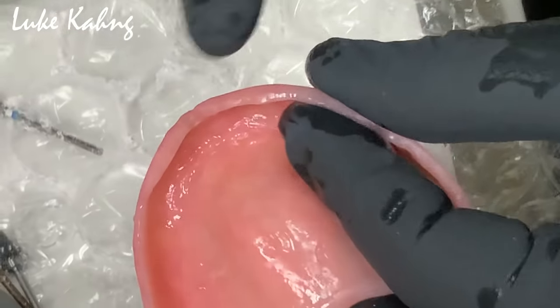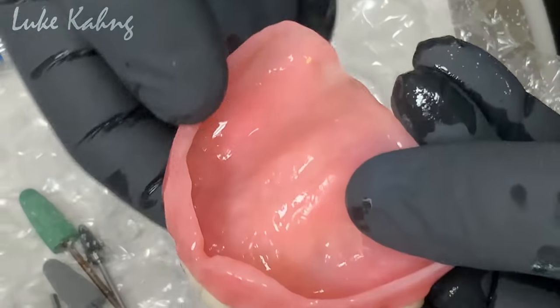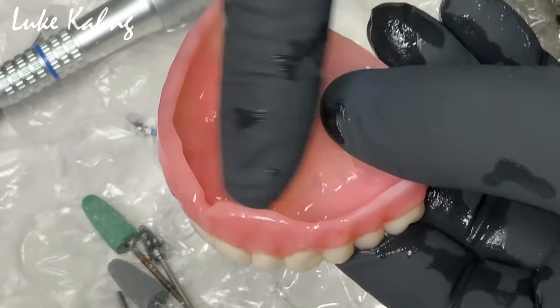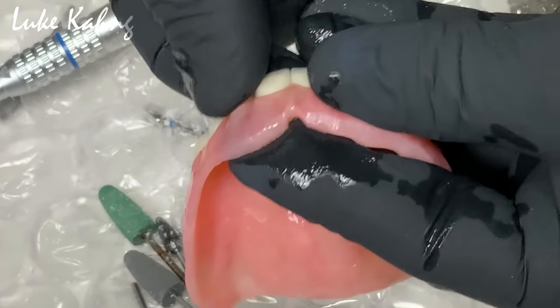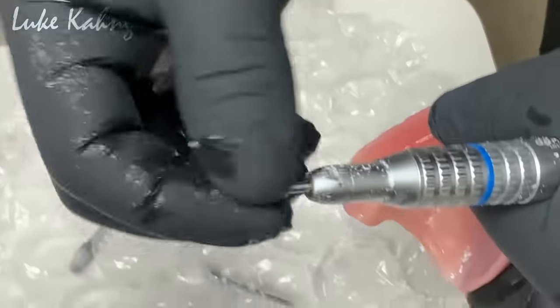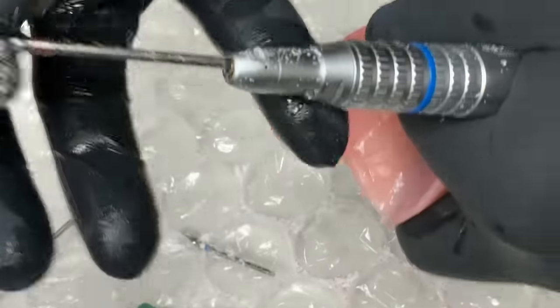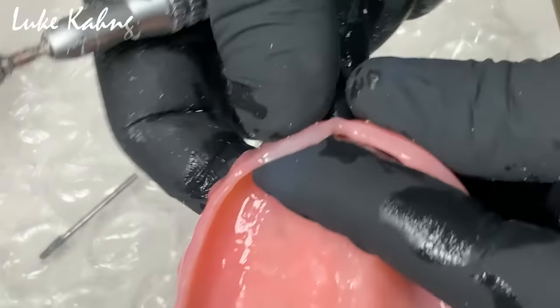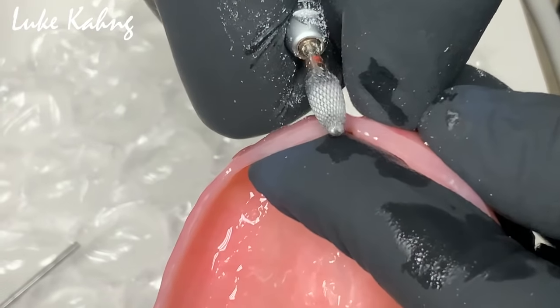Yep. Got it? So once I have the borders all correctly adjusted to where the length of these flanges into the sulcus are of the right distance, then that's when I actually come through. I'll hold it right behind it like this, right? And then this one we only use to make enough room for the frenum. We go back to the red, just like that. And that's where you can see this right here. I'll bevel it a little bit so it doesn't feel that thick on the patient. So right here, you bevel it, right?